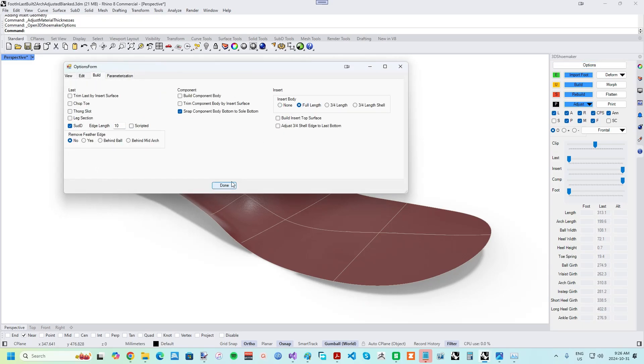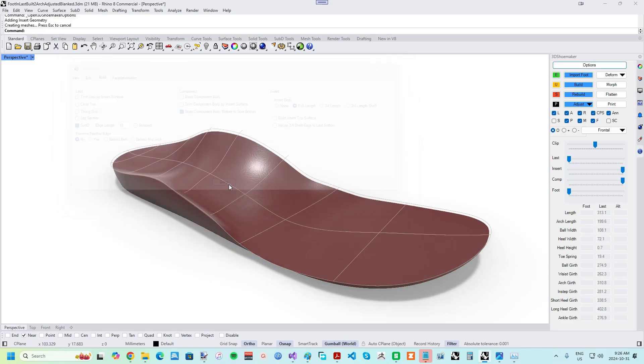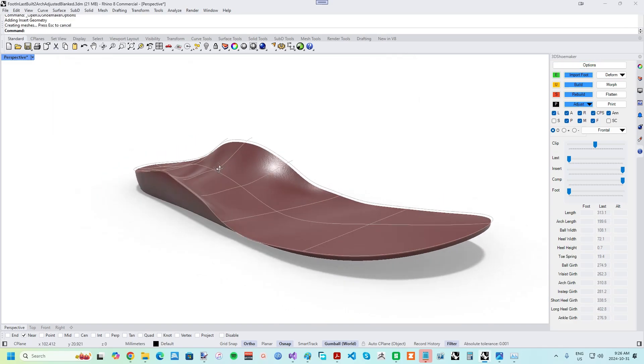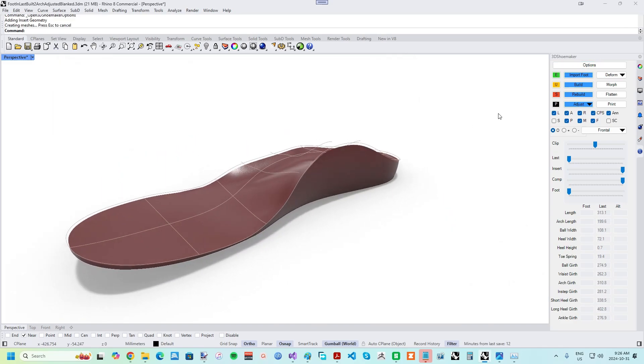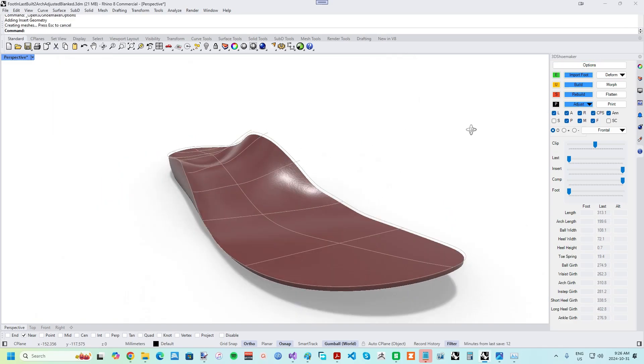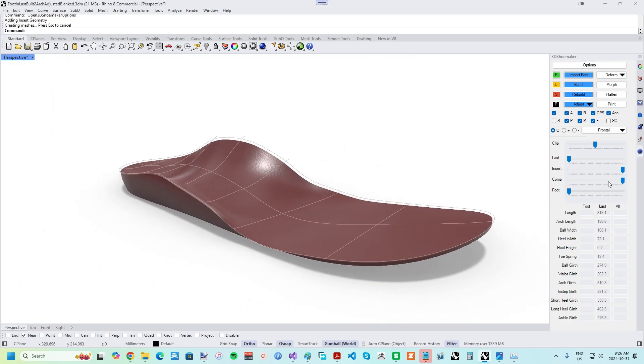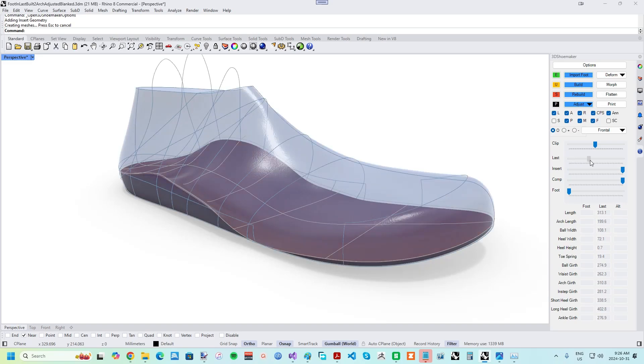Open the Options Form, and on the Build tab, you can select whether you want a full-length three-quarter or a three-quarter shell orthotic. Press Done, and the orthotic body will be added to the document.